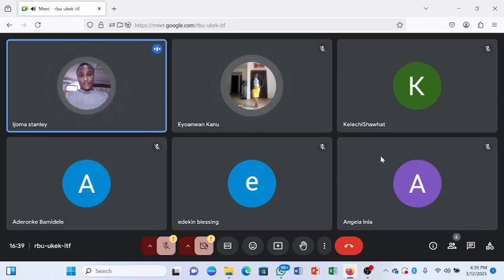Then you have the 24 hours urine specimen, which is the third one we're treating today. Here, urine is collected over 24 hours. How do you do it? You're given a container. Maybe a particular time of the day, you can say 10 a.m. They will tell you to start, each time you urinate, put it inside that particular container. Just be urinating inside that container for the next 24 hours.